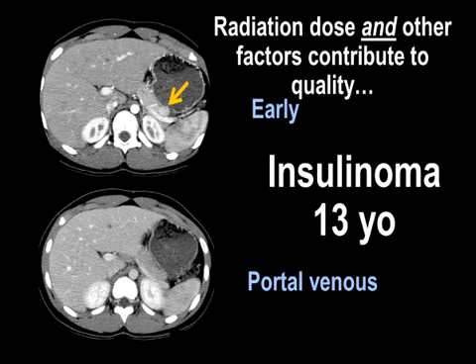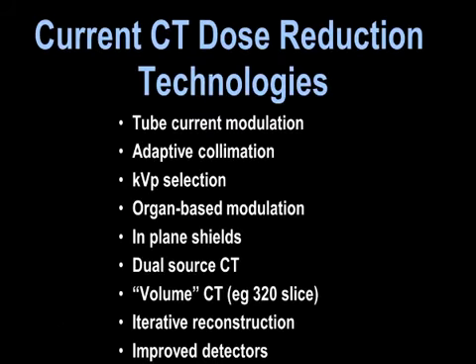So, again, it's paying attention to all the issues with CT, which are going to add to your patient, to the quality of scans, and optimize your dose protocols. So let me go through in the next 15 minutes or so some of those things you've heard about and will hear about, but again, more of an application standpoint here.